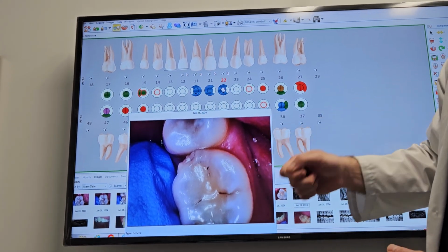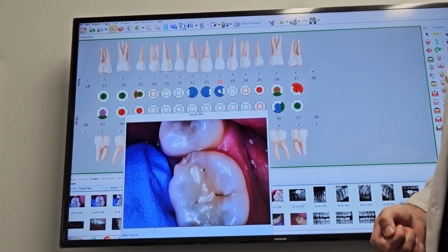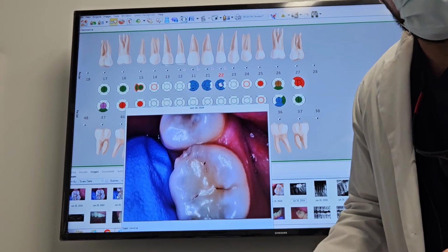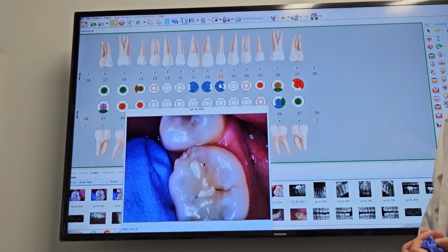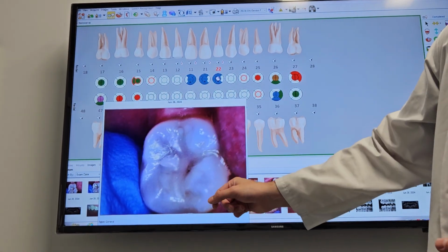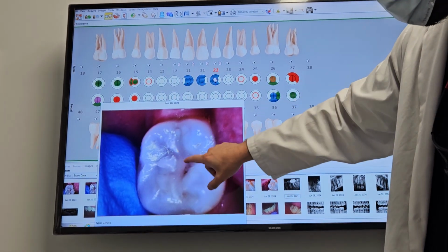When I poke at this, it's sticky. Stuff comes out. It's like when you have an apple and there's that little bad piece. You cut it off and the apple's all good. The same thing with the tooth. And then here's the last one, and again, it doesn't look too bad on the X-ray. This is deep, and what gives it away is dark discoloration.